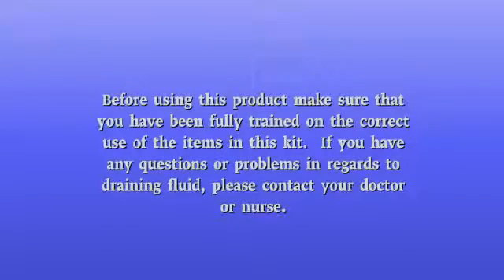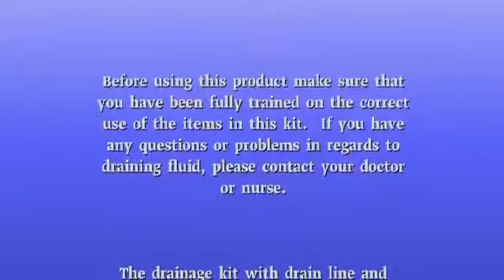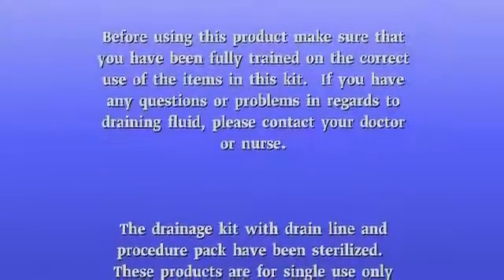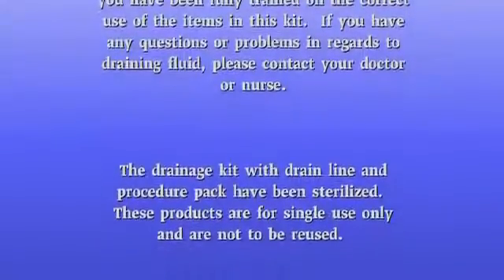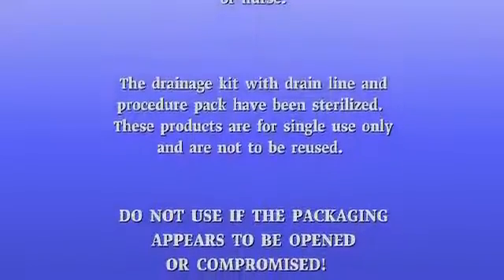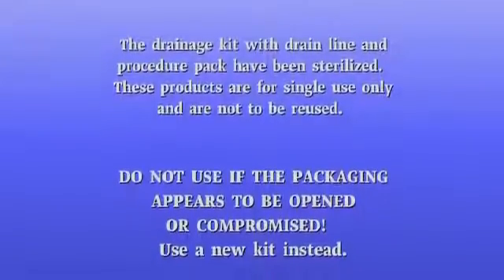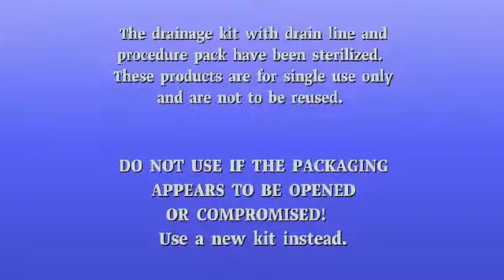Important product information. Before using this product, make sure you have been fully trained on the correct use of the items in this kit. If you have any questions or problems in regards to draining fluid, please contact your doctor or nurse. The drainage kit with drain line and procedure pack have been sterilized. These products are for single use only and not to be reused. Do not use if the packaging appears to be opened or compromised. Use a new kit instead.